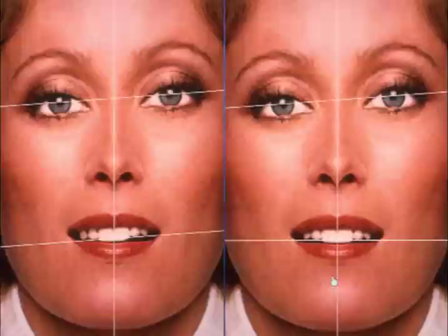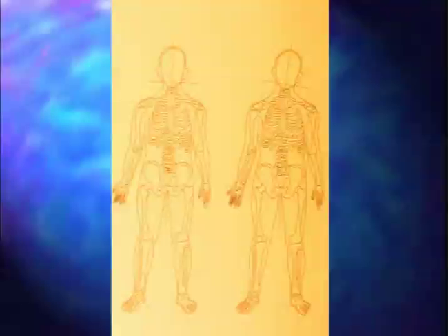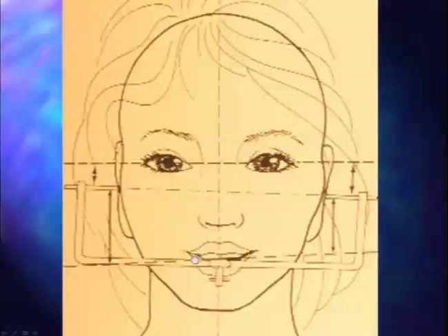In other words, teeth are part of the hard tissue system and should be related perpendicular to the vertebral column. Well, face bows and true hinge axis bows are not related to the eyes or the horizon. They're related either to the true hinge axis or the ears, which may also be uneven. And of course, even though these teeth may be functionally correct, they look aesthetically bad when they go to the mouth based on a lack of aesthetic information.